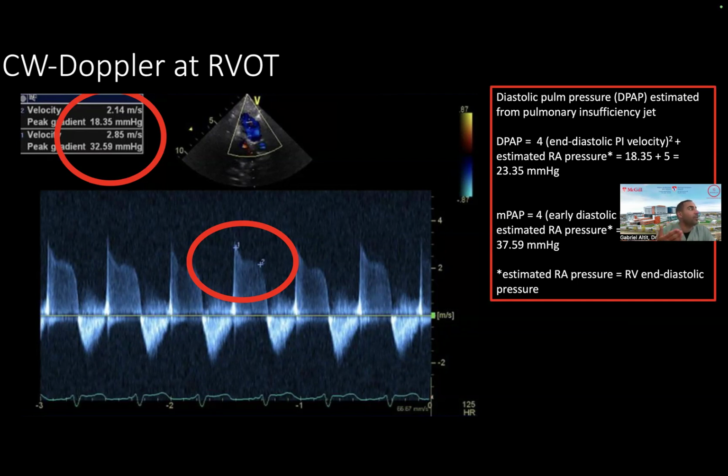As your LV and your RV are getting filled, the pressure in the cavity during diastole will rise because anytime you take a box and you fill up fluid in it, your pressure along the wall will become a bit higher, right? You get a bit more wall tension. And so that's why you see this particular pattern of initial higher pressure. And as the diastole goes further, you start losing a bit of that pattern.